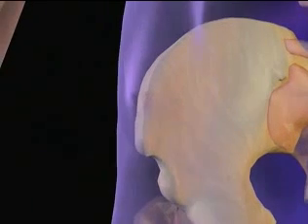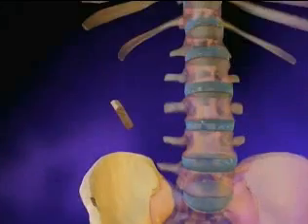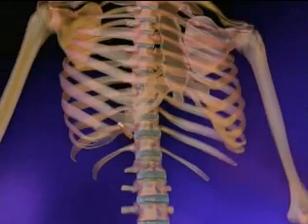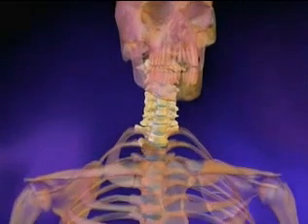One method for vertebral fusion involves implanting small pieces of the hip bone between the injured vertebrae. These small pieces of bone will combine or fuse with the existing vertebrae to create one solid bone.